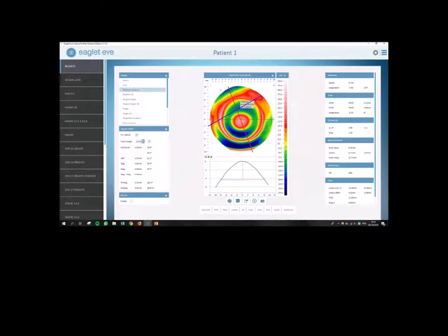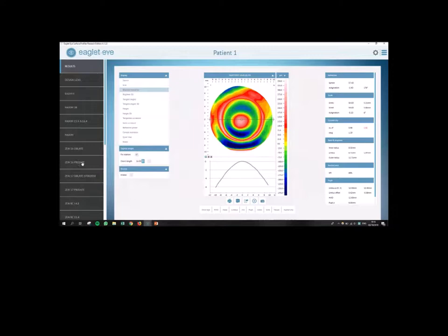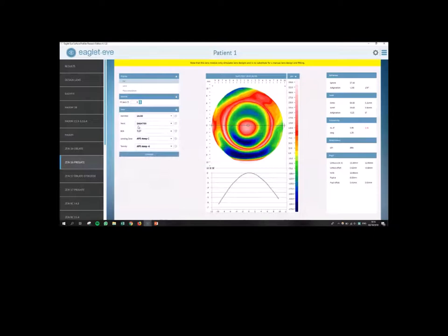The other thing that we can see over here is that there's a red markation on the sclera up on that edge. And over here, it seems like it's more blue. So we would expect toricity in the landing zone this time. We would expect a toric sclera. This is because it's more depressed down here, and it looks more elevated, more red on that area. So of course, there's a way we can check that. In this case, I'm just going to click on a Zenlens, a prolate lens, and we're going to see what it's suggesting.